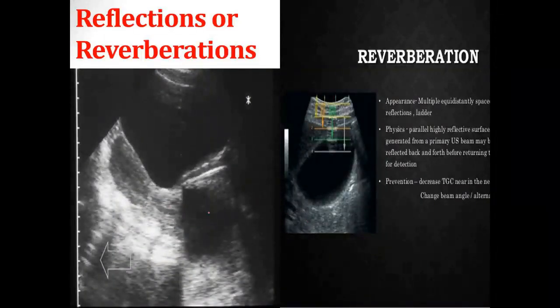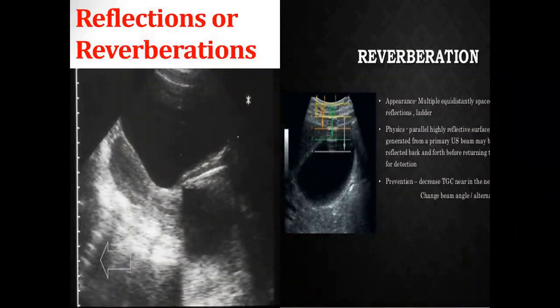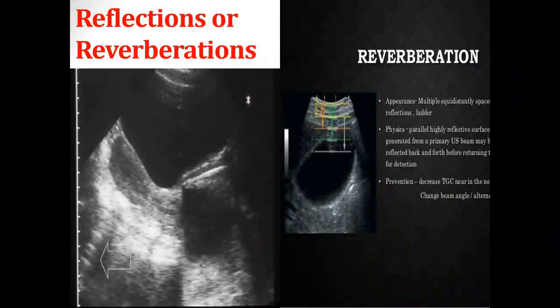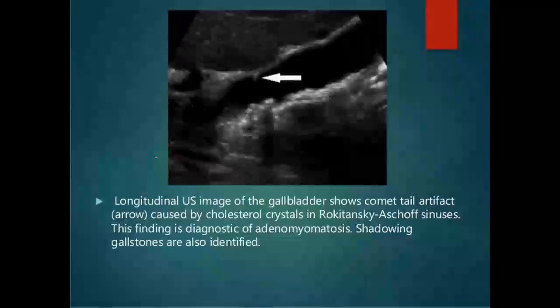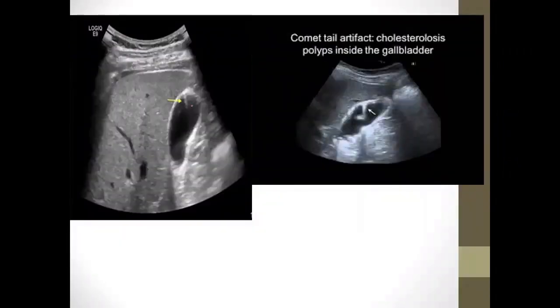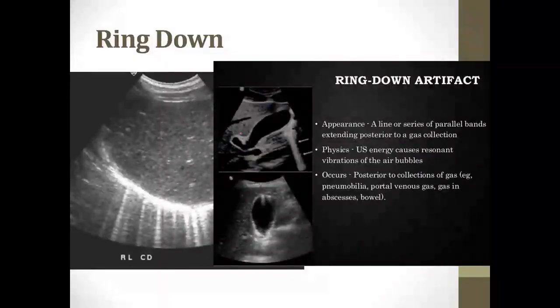Of course, these images may be artifacts for you, but we might talk about them in a way related to physics, explaining why they appear in this specific form, for example, and also showing different shapes that exist, including the ring down.